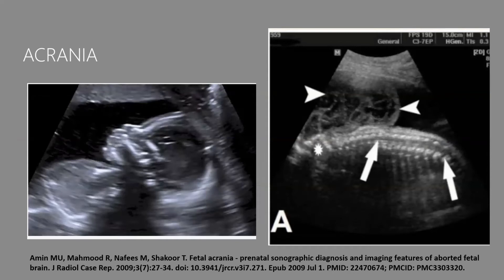Now we'll look at acrania in more detail. The reference slide shows a normal fetus on the left with a hyperechoic line around the skull as expected. On the right, where the two arrows point, there is no strong hyperechoic line — no skull holding the brain matter in place — and the brain is essentially floating in the amniotic fluid.